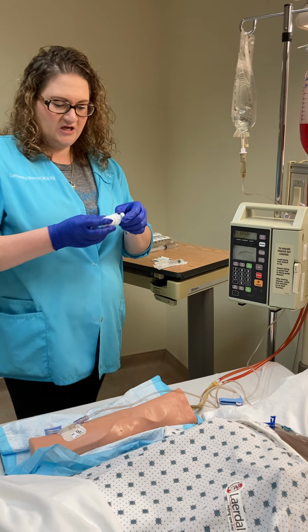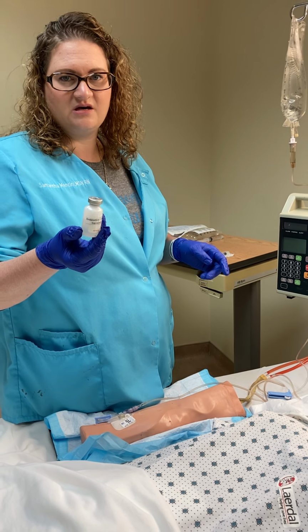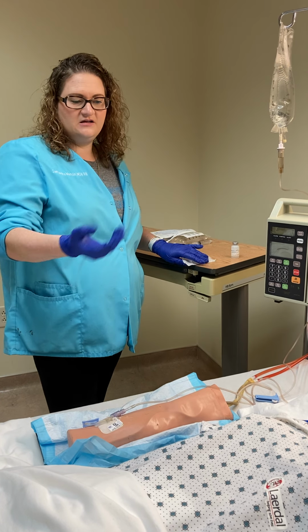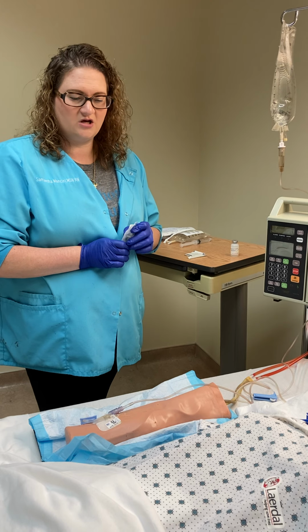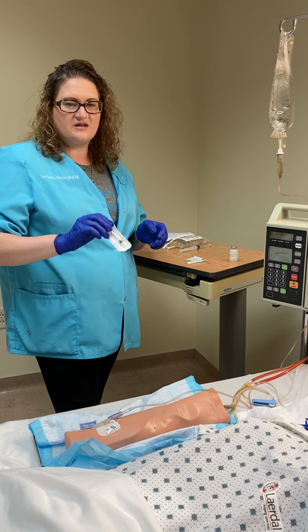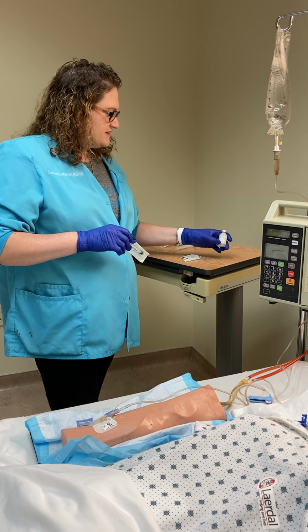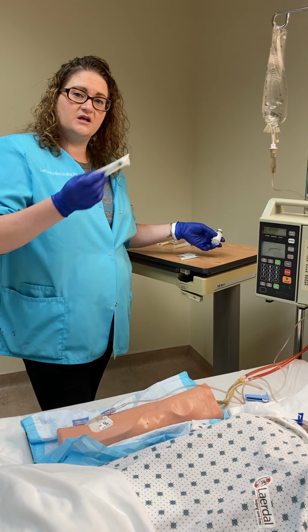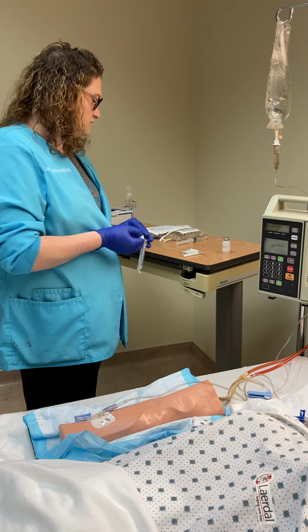So we're going to give the patient some ondansetron, which is Zofran. We're using it for nausea or vomiting. We say that he does have an abdominal surgical wound, and he does have some nausea. So he had pain medicine a little bit ago. Now he's having some nausea. This is 2 milligrams per milliliter, and the order's for 4 milligrams. So we're going to give a total of 2 milliliters. We're going to give it right through our line here.